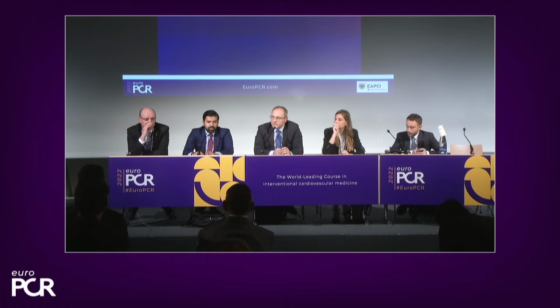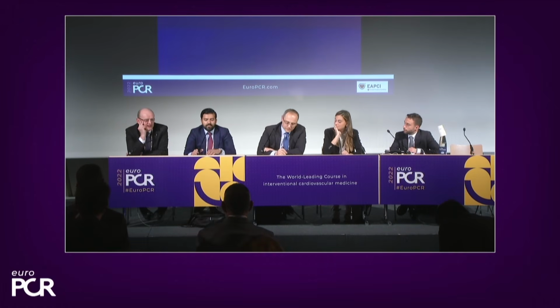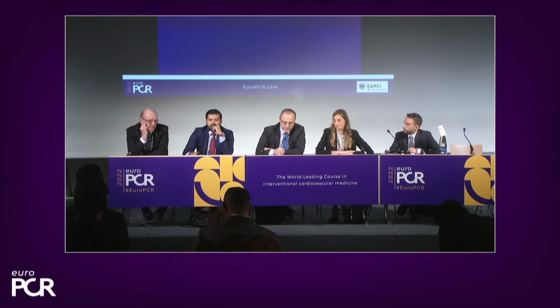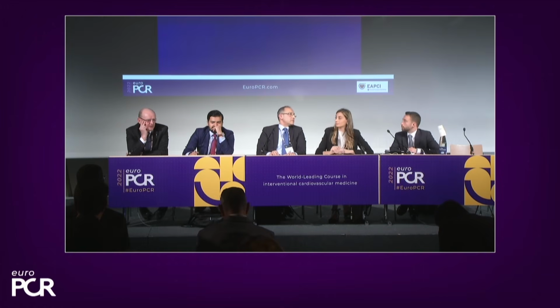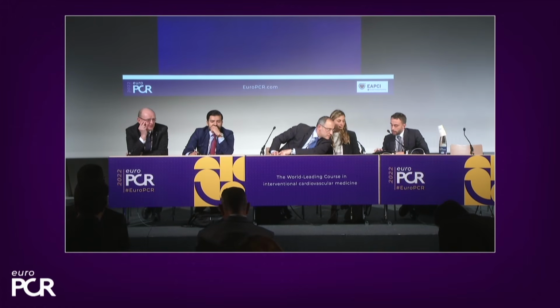We heard to check the final stent result, but what is the result we are aiming at with IVUS? Is there anyone who wants to explain what the key parameters are when optimizing the stent and checking the stent? So the Kang data, 5, 6, 7, 8, I think is probably a minimum. There's been debate about whether those standards are stringent enough for a European population, but you certainly must achieve 5 as a minimum at the ostium of the circ, particularly if you use 2 stents, and 6, 7, 8 is easy to remember.